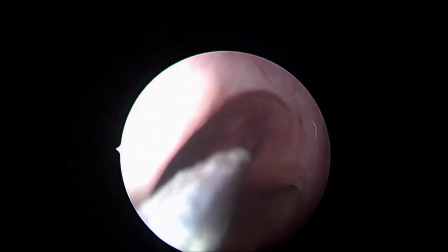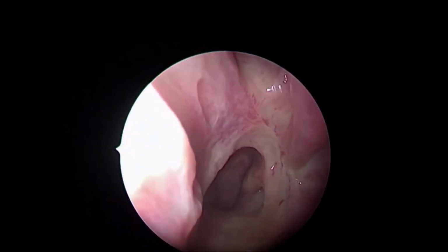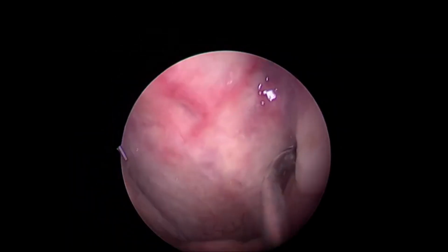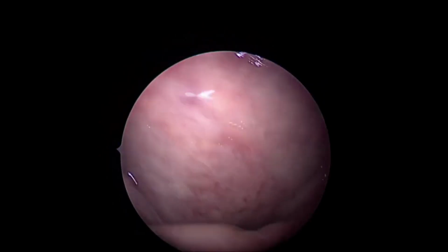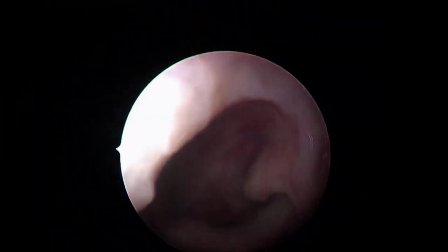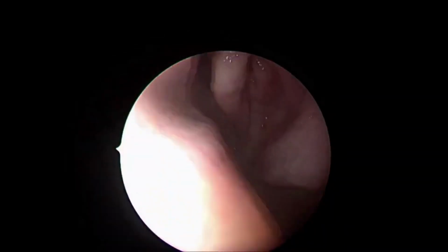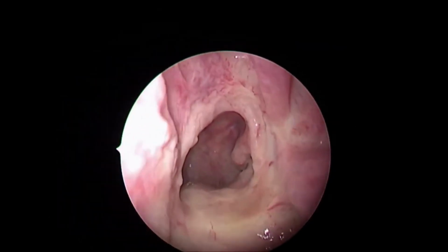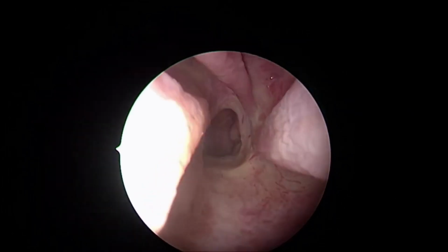ear. And there is another space behind this, which for the skull-based surgeon is very, very important. We'll see later how important a landmark it is. As I go behind, there is a cleft enclosed behind the eustachian tube, far laterally. That is the fossa of Rosenmuller, which is a very important landmark for skull-based surgeons, pointing towards the parapharyngeal carotid artery.